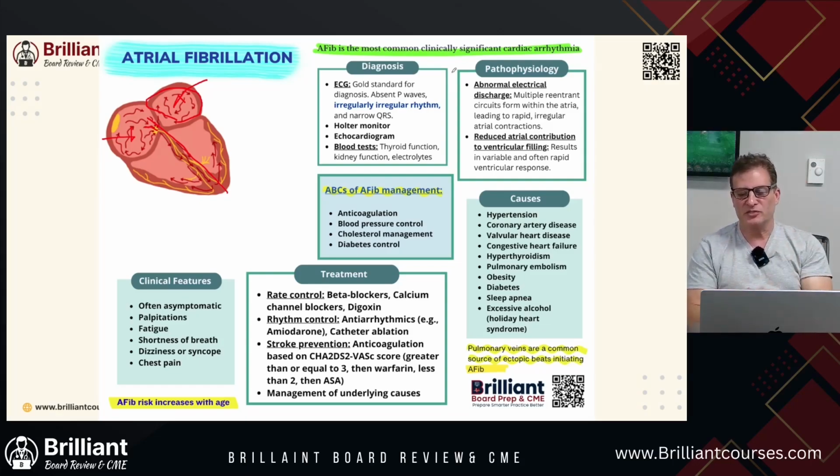So basically it reduces the complications. It's less likely to form an atrial esophageal fistula, that's between the atrium and the esophagus behind it. That could happen under the old technology and with cryoablation. It was a rare risk, but it was a risk. So basically the technique for ablation has gotten better and safer. And then we'll talk about why ablation is being used more and more.